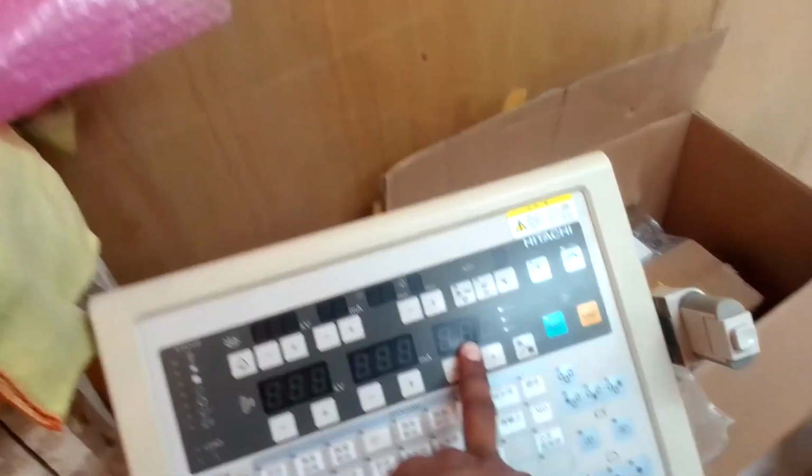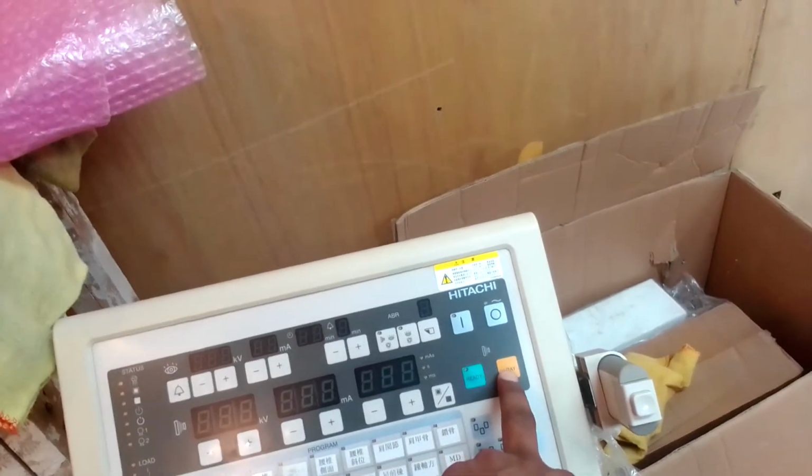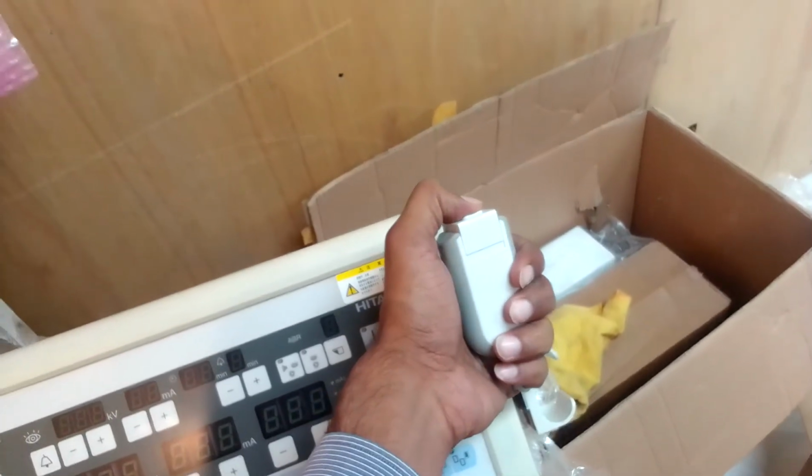And there are two methods to expose. From here you can ready and X-ray emits, ready and scan, and also you can do the same thing from this button, ready, expose, the exposure switch.